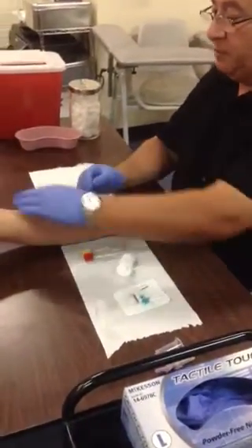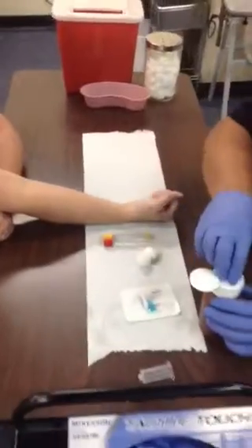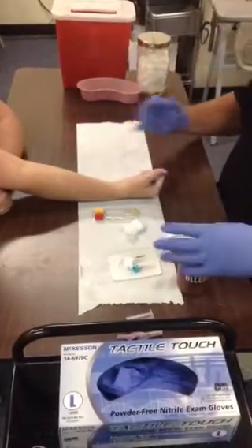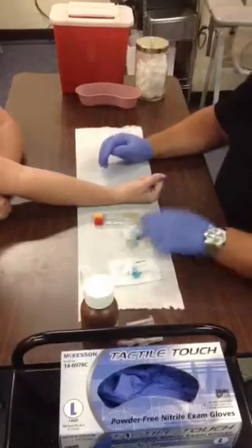We're going to use the bend of the arm. Feel for a vein. Once you find a vein and you've established the center of the vein, the depth of the vein, and the direction, go ahead and clean using small to larger circles. Take your first cotton ball and wipe from small outward — make sure these are nice, firm wipes, not soft wipes. You have to break up the debris and clean as best as you can.